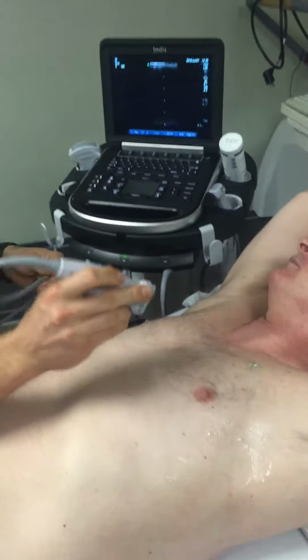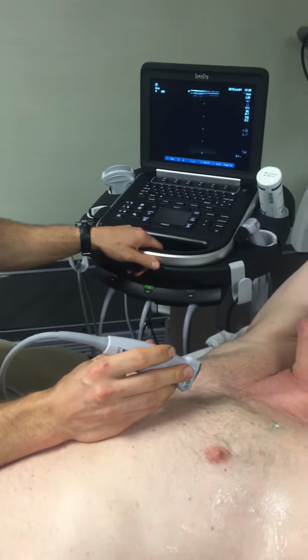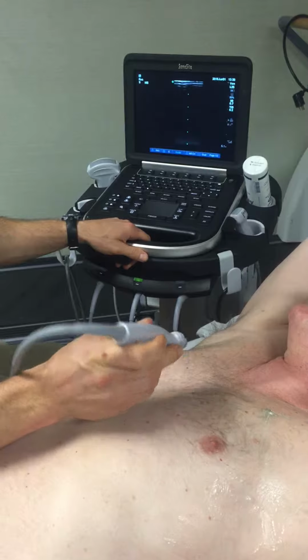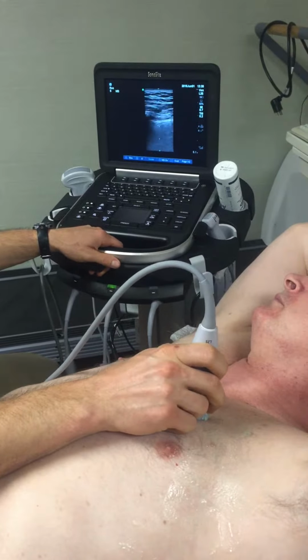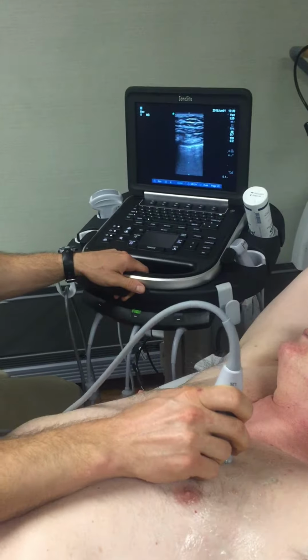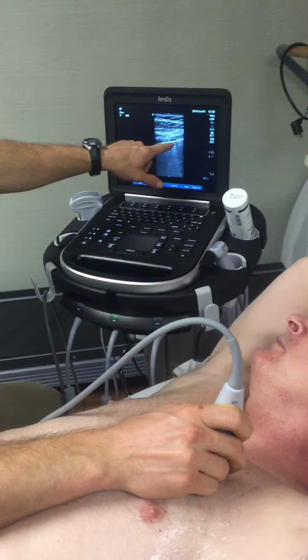And so for the lung exam, you can approach it for a pneumothorax and you can just look anteriorly. Air rises, and so we'll start with the most anterior view of the patient. You want to center the pleura, and you can see between the ribs. Here's the pleura. Take some nice breaths.